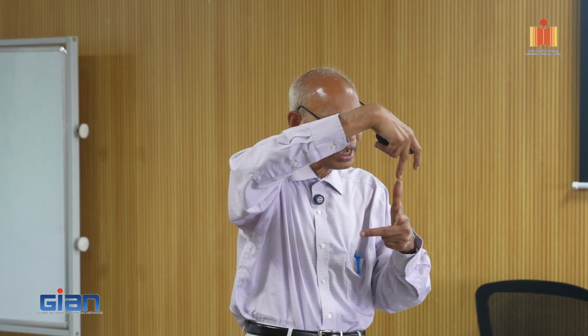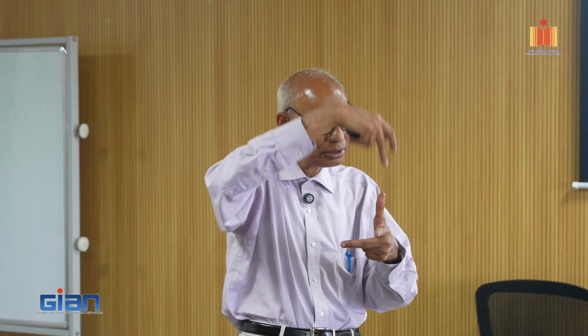In a coordinate system, you have X, you have Y, you have Z. In the Z direction, the beam is coming that way. So this is the longitudinal direction. These are the lateral, transverse directions. In the transverse direction, we call it transverse profiles. In this way, you call it longitudinal profile.